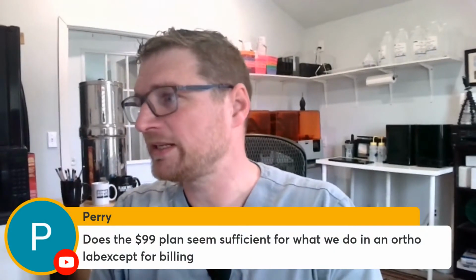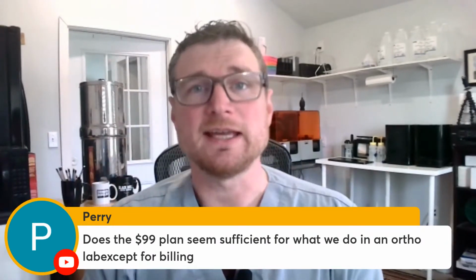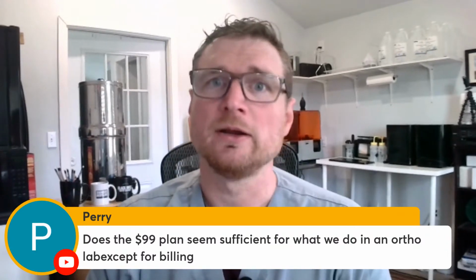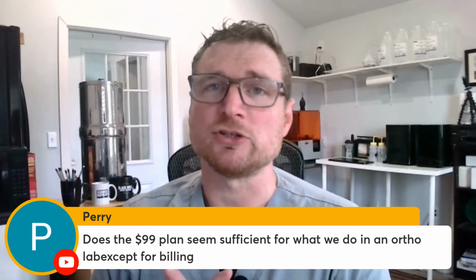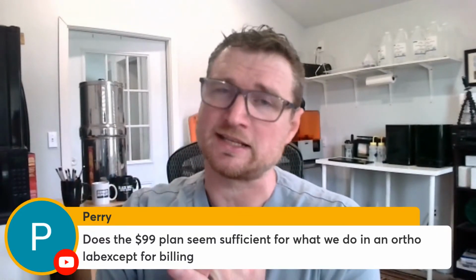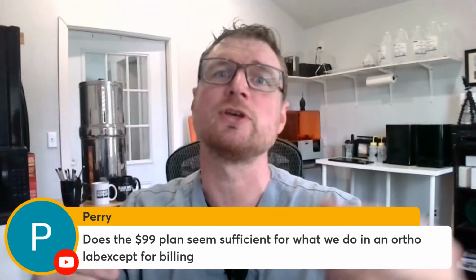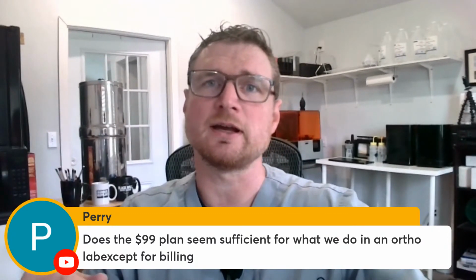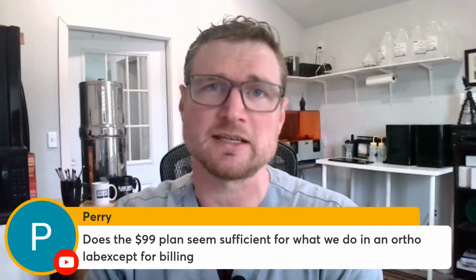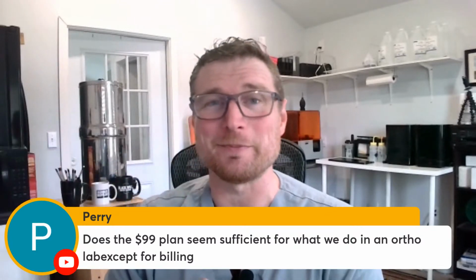So, does the 99 plan seem sufficient for what we do in an ortho lab except for billing? Yes. Yeah, the 99. I believe that includes this 3D editing software that I'm about to show off. But I don't think it includes the auto base and the auto bracket. That's an extra charge on top of that. But yeah, the 99, you can receive cases from doctors and manipulate files with that. I think it's the basic EasyRx 3D feature. I think they've changed the packages since I signed up. But I do have the enterprise.